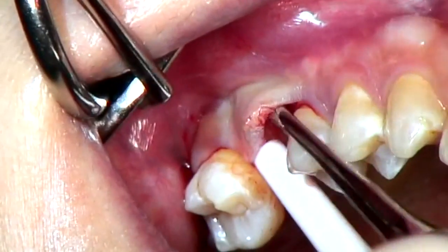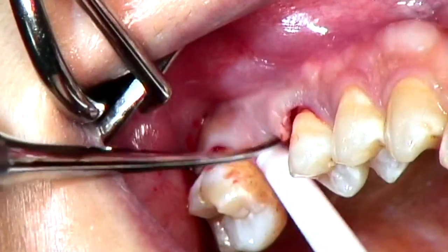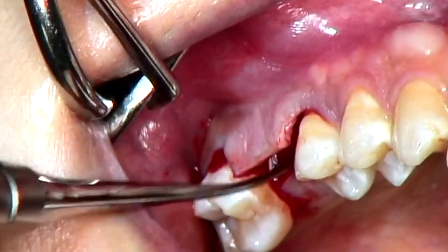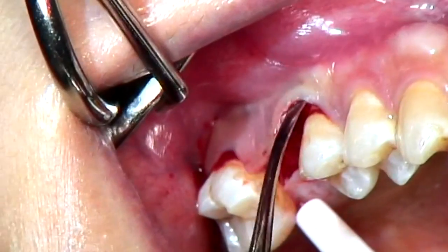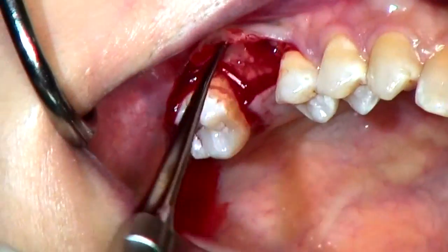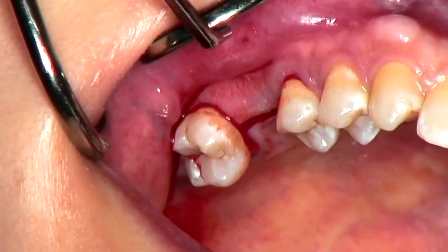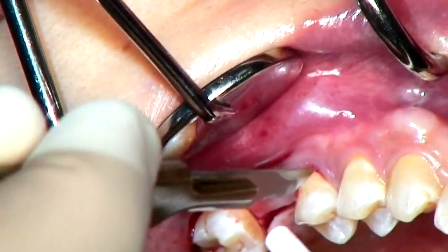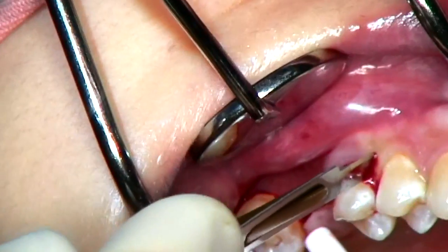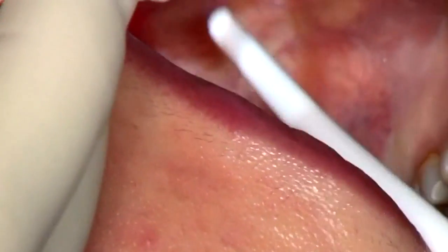Sometimes starting from a mesial direction towards the distal with gentle distal movement and pressure. We are not going to place an implant most likely today, so I do not need to detach my palatal flap right now. Once I have a good grip on the bone, I will continue with my release incision — the same principle: the first incision is 90 degrees against the tooth surface so that I create a flat-to-flat contact. From this point onwards I can continue just extending this apically.